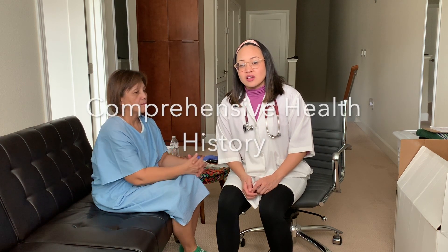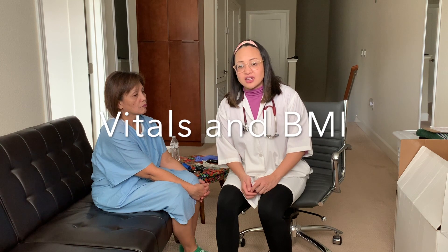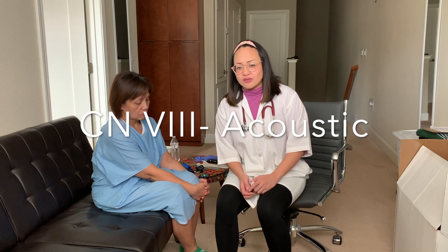Hello, my name is Trisha Badong and we will be doing a head and neck assessment on a patient. Before we start the exam, we need to have a complete comprehensive history that has been taken already. Make sure we check the chart for vital signs, the visual acuity which checks for cranial nerve number two, and also the audiometry testing which checks for cranial nerve number eight.